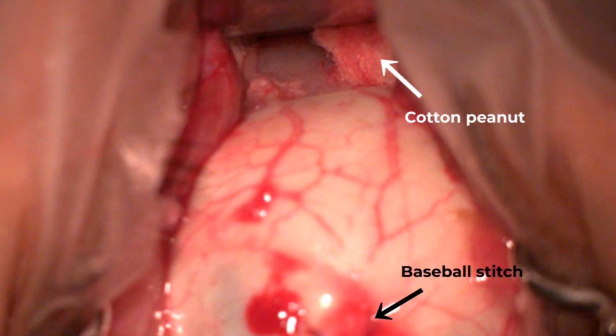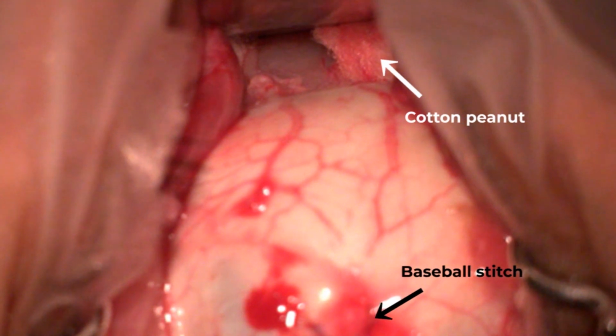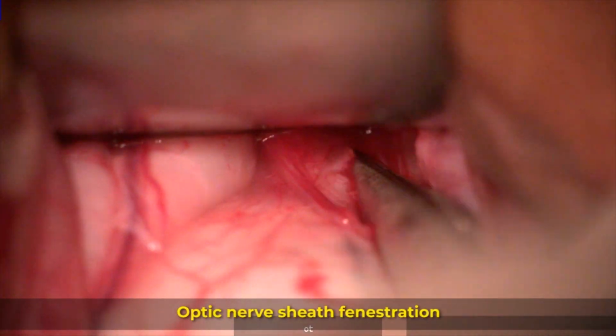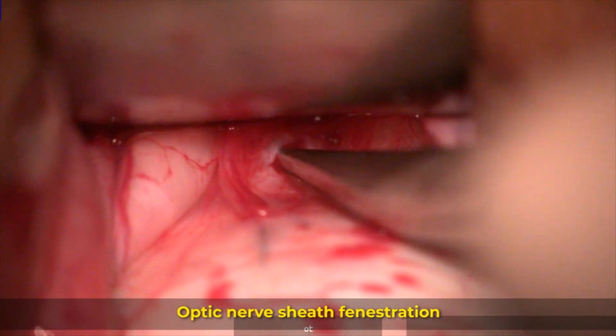As you can notice, the optic nerve sheath is so enlarged that it can be seen even without retracting the baseball stitch. And with one go, see the amount of fluid gushing out. Then we have done a fenestration. Then with the help of blunt scissors, we break any adhesions underlying the sheath.